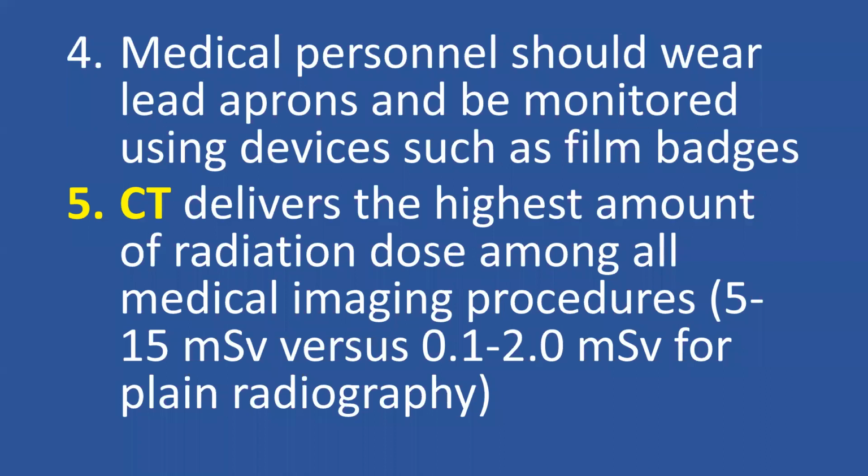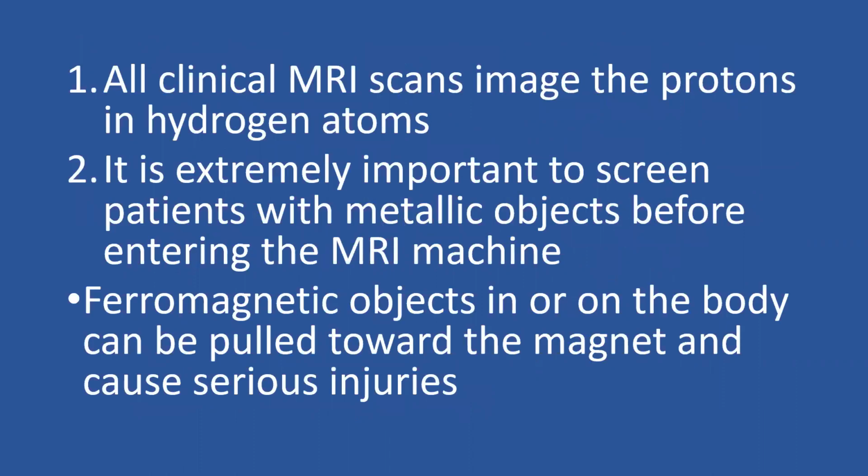Medical personnel should wear lead aprons and be monitored using devices such as film badges. CT delivers the highest amount of radiation dose among all medical imaging procedures. In conclusion, for this section, all clinical MRI scans image the protons in hydrogen atoms. It is extremely important to screen patients with metallic objects before entering the MRI machine.